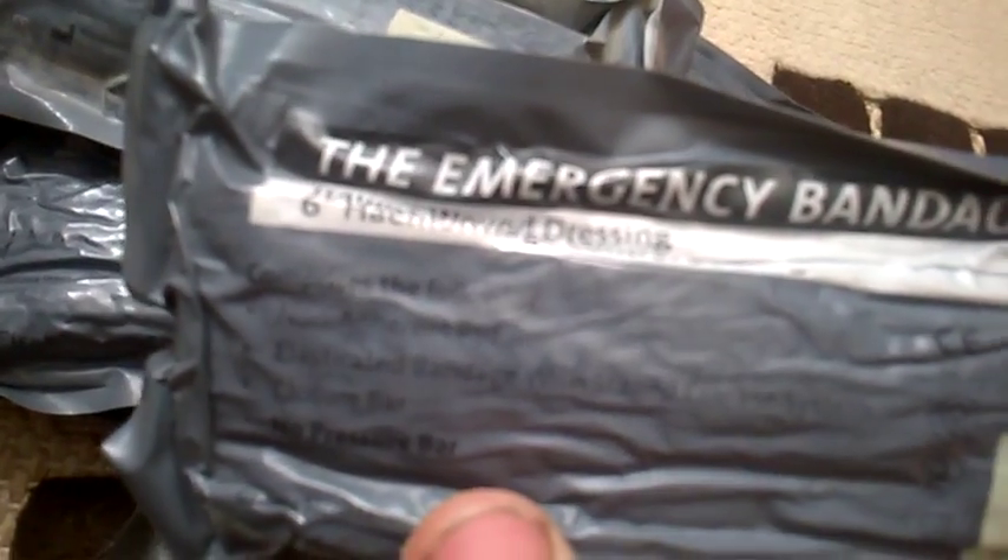Let's show the contents of the Israeli bandage. It says: non-adherent pad, elasticated bandage with staged release system, closure bar, pressure bar. The expiry date on these is 2016, so there's a little time left on them. As you can see from all the dirt and grime in the wrapping, these have been to Afghanistan and not been used — thank God. Non-used medical equipment is always nice to see, because it means no one's needed it.